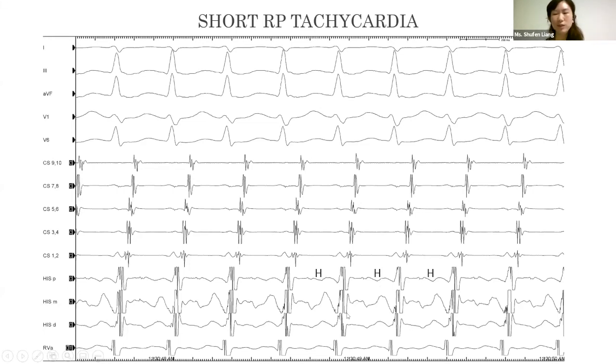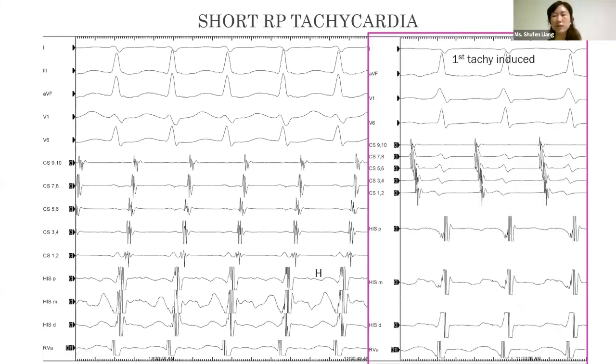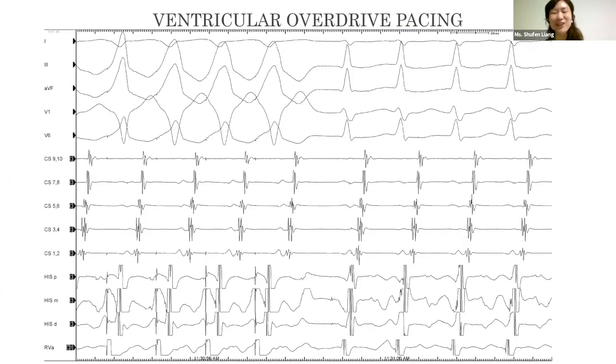So I can give you a comparison of the first tachycardia that we had and this tachycardia. The atrial activation is very, very different. And we can see here that we have lost the pre-excitation on the ECG. I worry that we do not have enough time. So here, we have done our maneuvers for you, doctors.